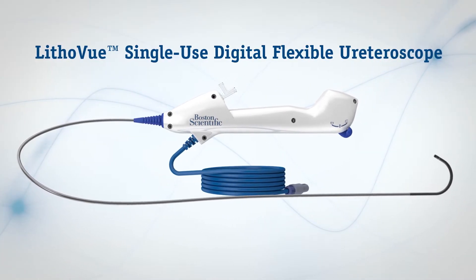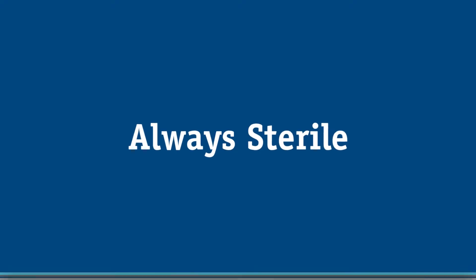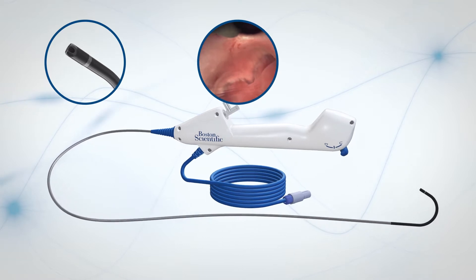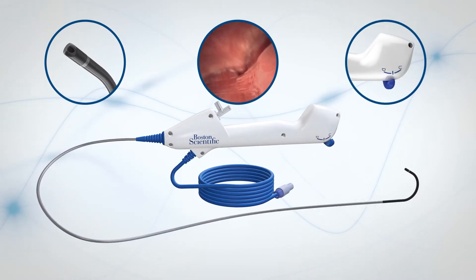With the LithoView FlexScope, your ureteroscope is always sterile, always ready. The small tip size, digital images, and flexible ergonomic design guide the way during ureteroscopy.